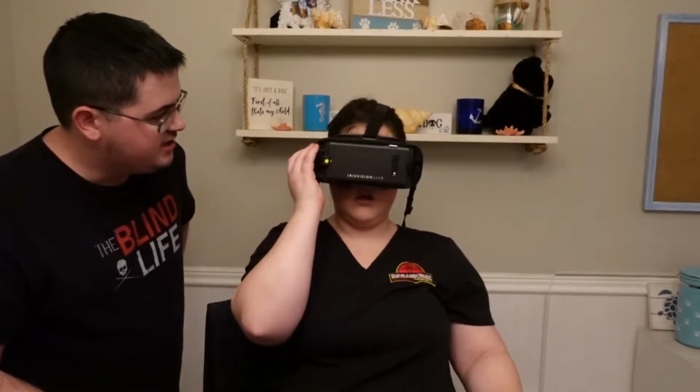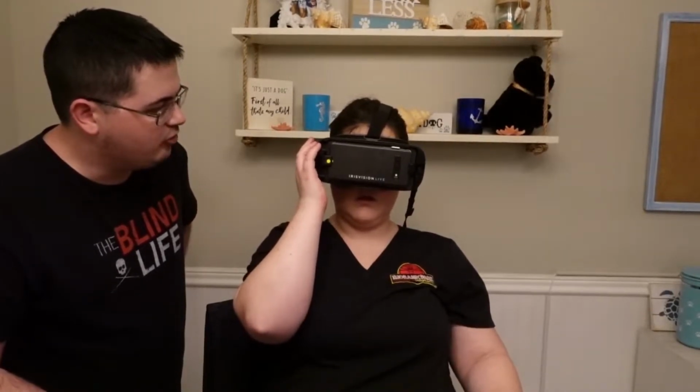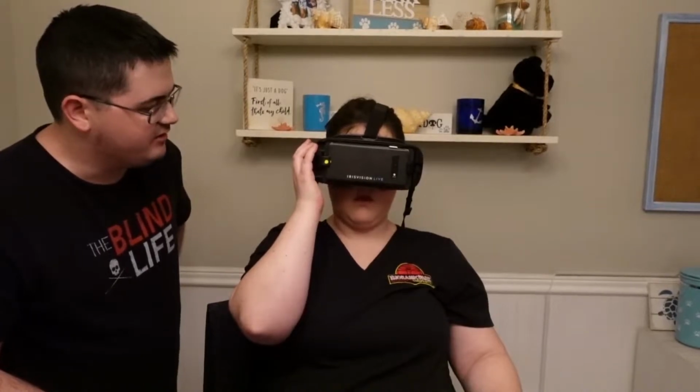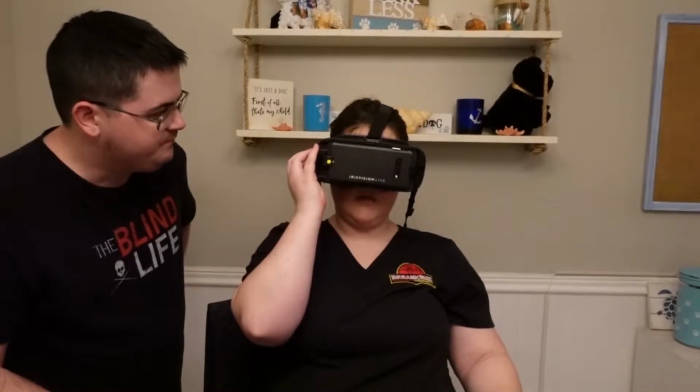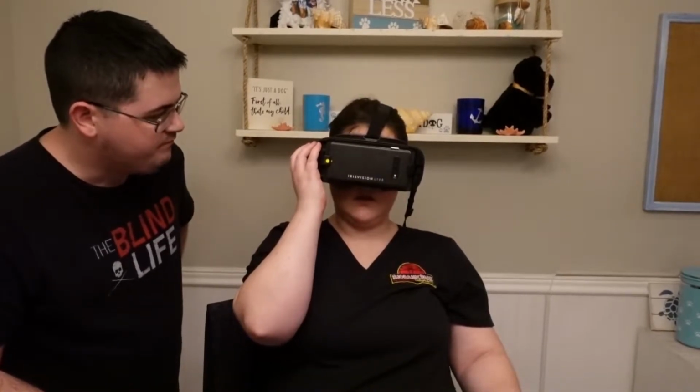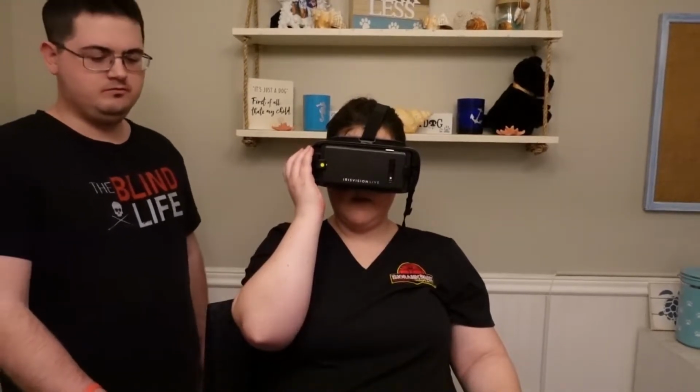You should see in the goggles, it telling you the different numbers of the zoom and the bubble size. Yeah, it just went away, but every time I do it, it does. I don't really like the bubble, personally.